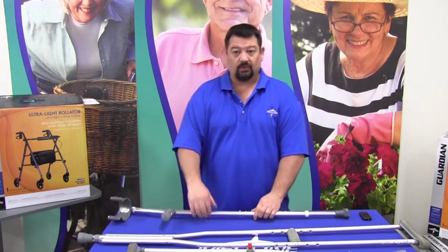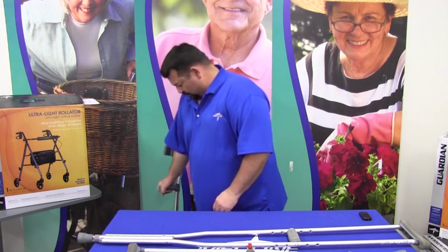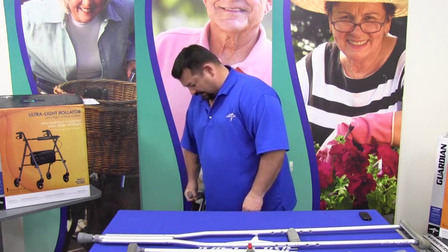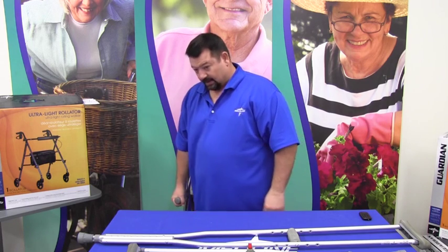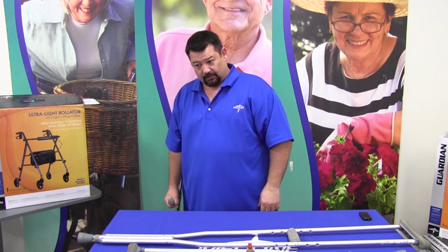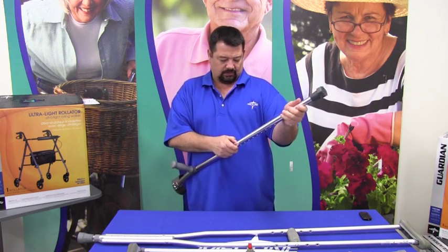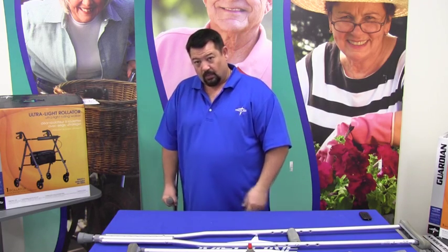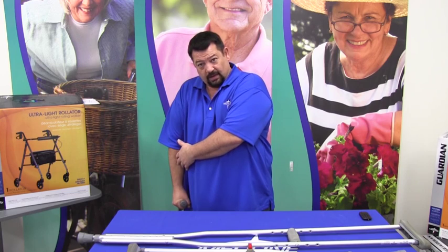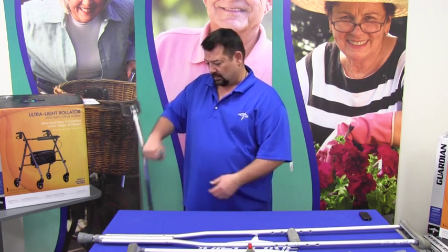Now what you simply do, again, is take that measurement from the ground to the crease of the wrist, and at that point you can set it up, flip the cuff out of the way, and see that it's reasonably comfortable. For this, we're going to adjust it to me, and we want to have a slight bend to the elbow, but that's the proper height.